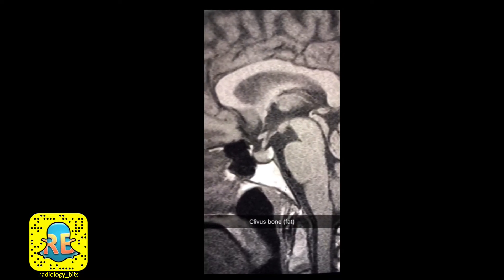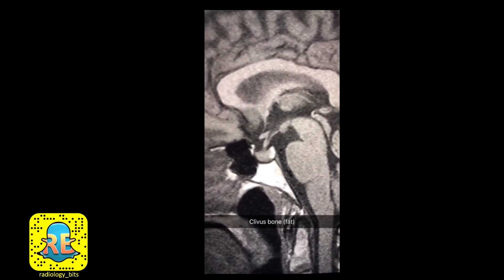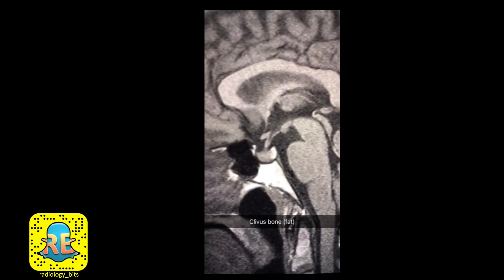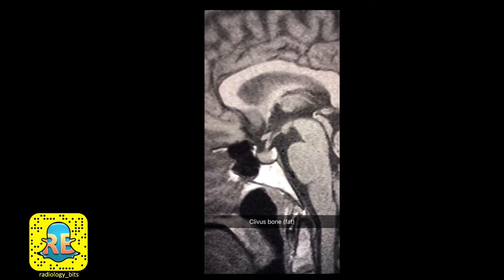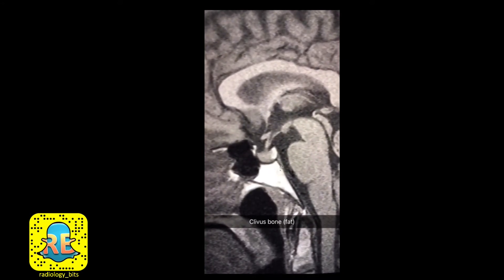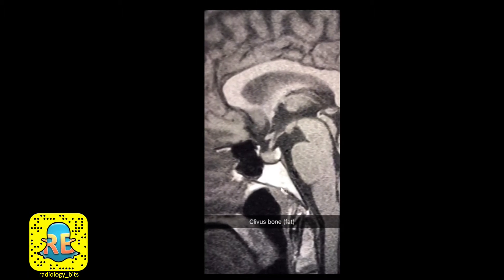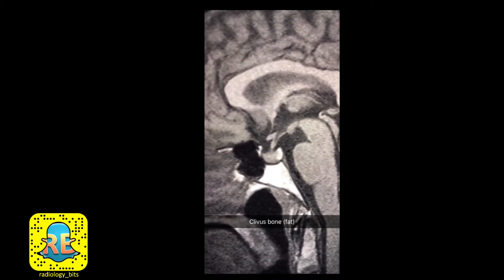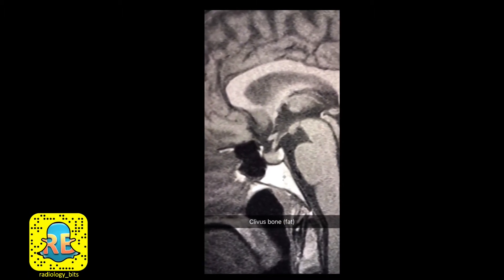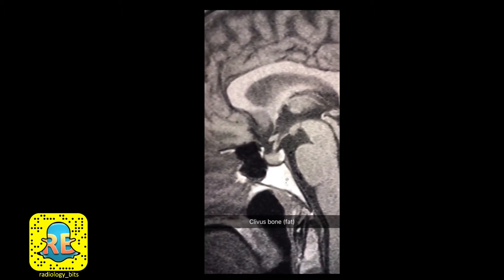Fat is very bright on a T1 acquisition. Here's a good example: this pointy piece of bone here is called the clivus, and it contains internal fatty marrow — that's why it's so bright on T1.